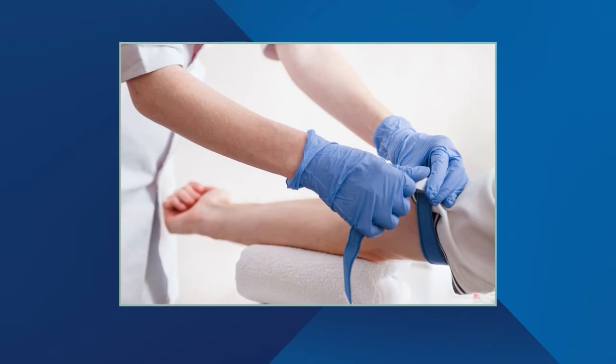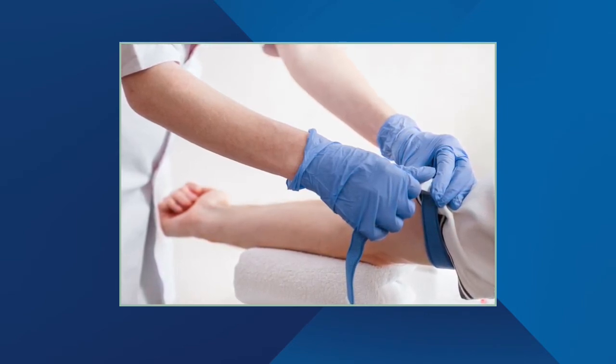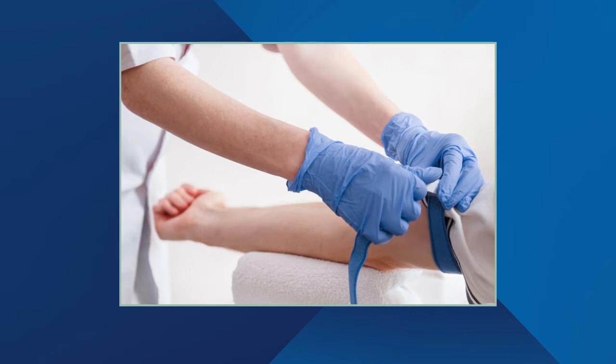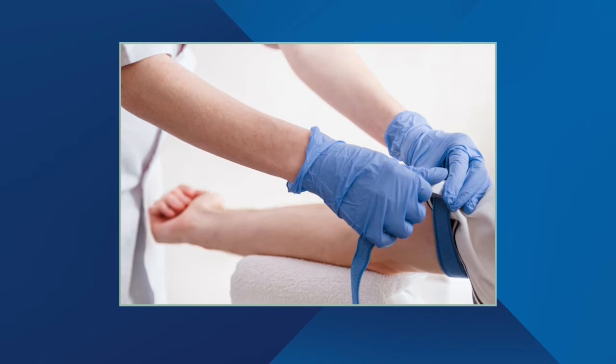Before you start using the device to find veins, please remember that this is an assessment tool to help you select a vein for cannulation. You should rely on your training and skills, such as palpation. Also, techniques like tourniquets help engorge the vein and should be used to aid in vein selection.